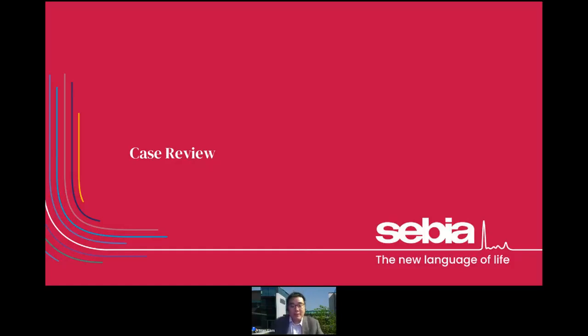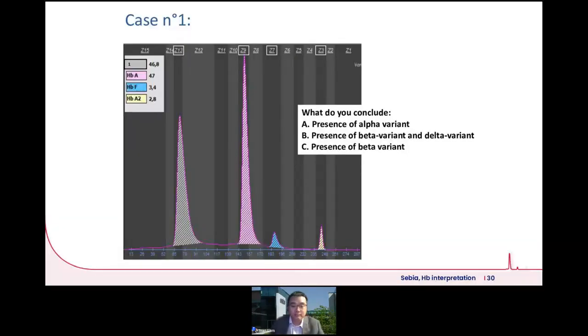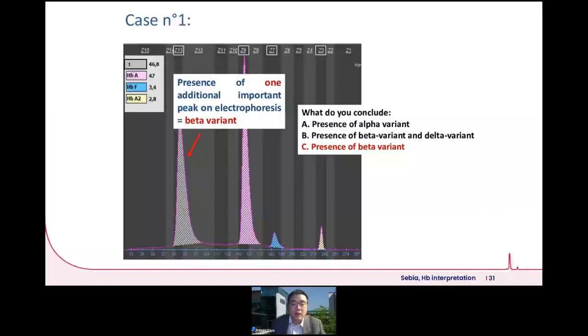So now let us look at some case reviews to reinforce our understanding of the principles of interpretation. So in this situation, you see apart from your hemoglobin A, which is the main peak in the middle, you see a very large peak on the left. Right, what would these very likely be? Okay, so of course, knowing that there's also a bit of increased hemoglobin F, most likely the patient has a variant condition that's affecting him significantly. Okay, so this is actually a condition of the presence of beta variant.